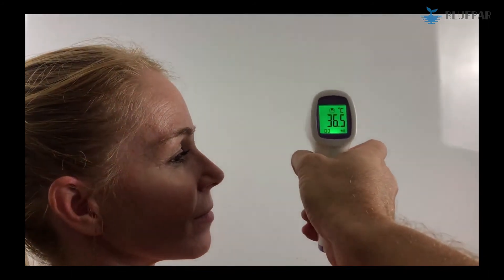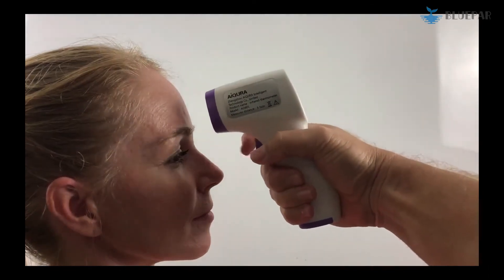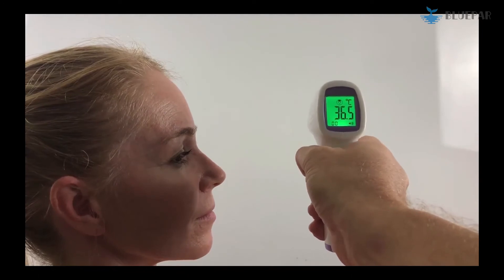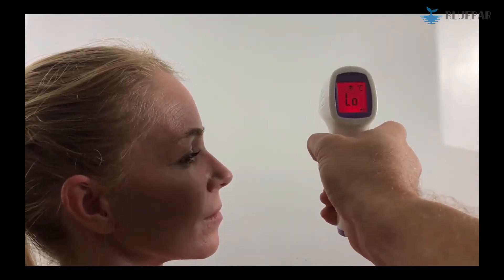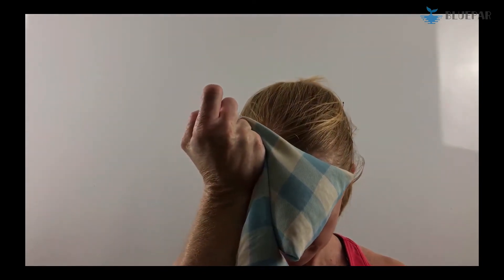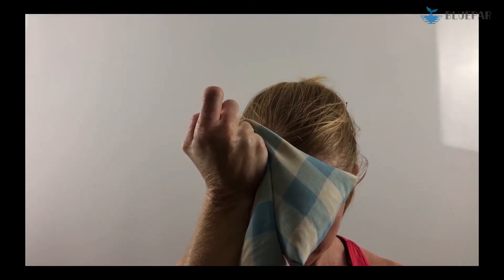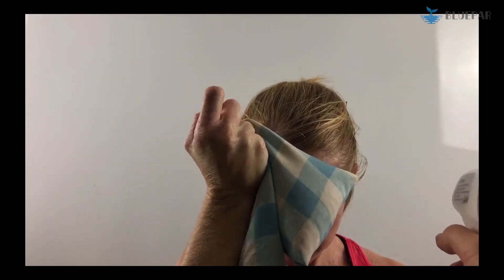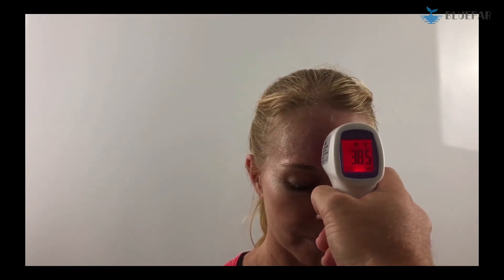An accurate sample will give you a green reading. When the sample taken is incorrect, it will indicate low. For demonstration purposes, we had the candidate hold a hot pack up against her head. When a sample is taken and the temperature indicates a fever over 38 degrees Celsius, the gun will flash red.